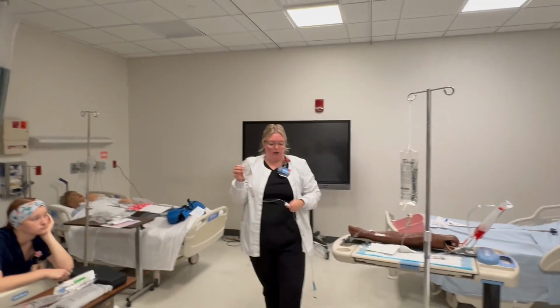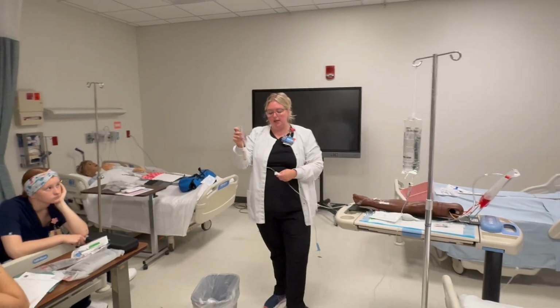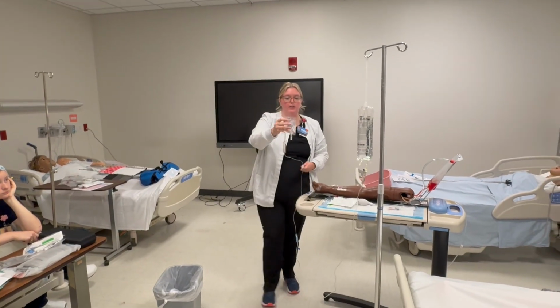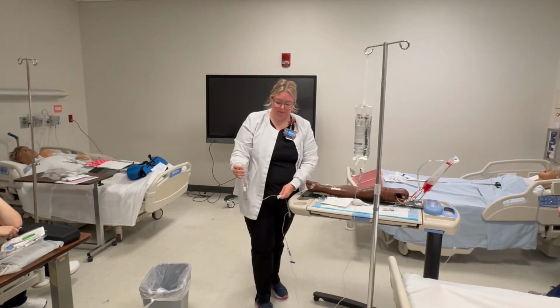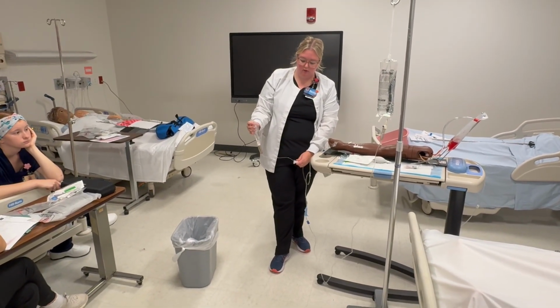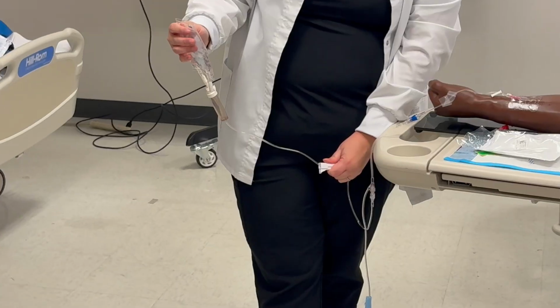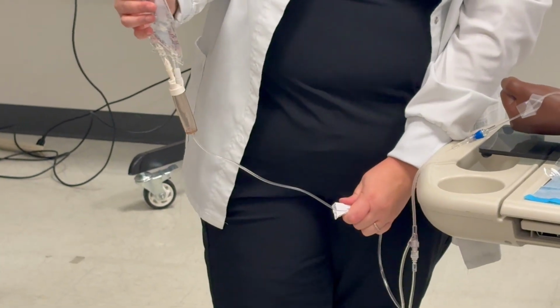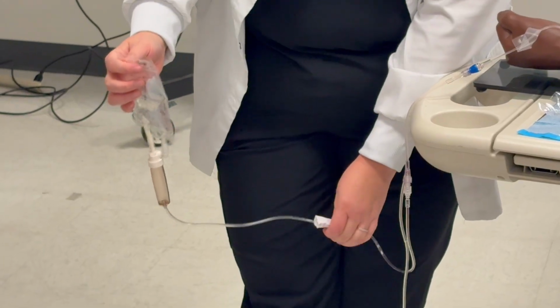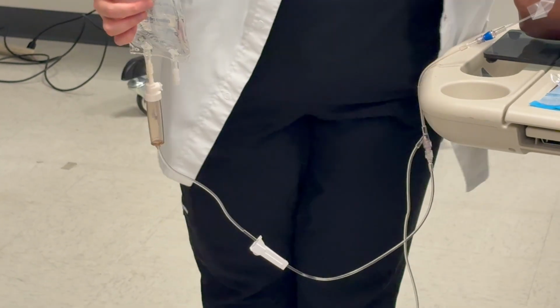So I'm going to, with this in my hand and my hand on the roller clamp, hold this below my primary bag, okay? And you're gonna watch, hopefully it works. Okay, it's working. You're gonna watch the primary fluid flow backwards into here very slowly because of where this is.